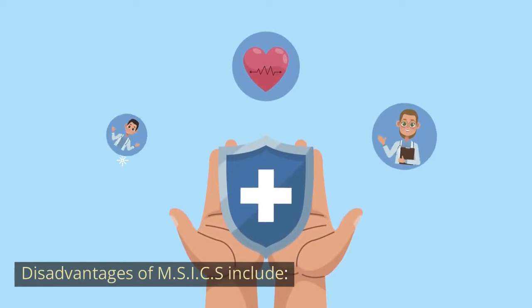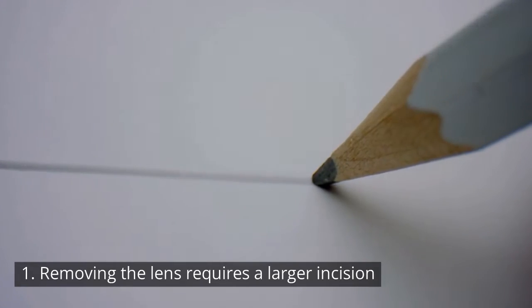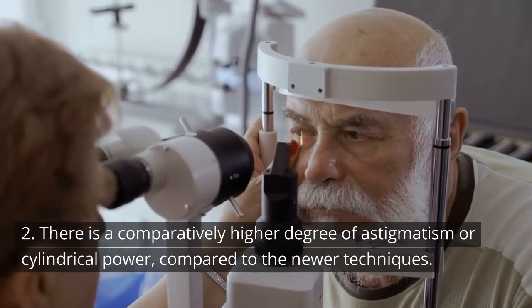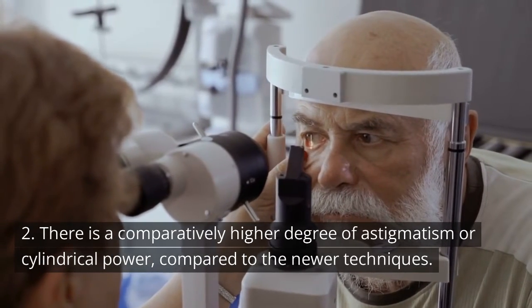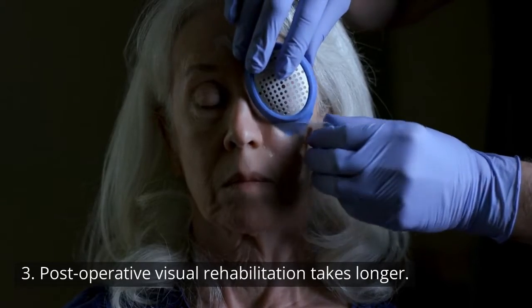Disadvantages of MSICS include: 1. Removing the lens requires a larger incision. 2. There is a comparatively higher degree of astigmatism or cylindrical power, compared to the newer techniques. 3. Post-operative visual rehabilitation takes longer.